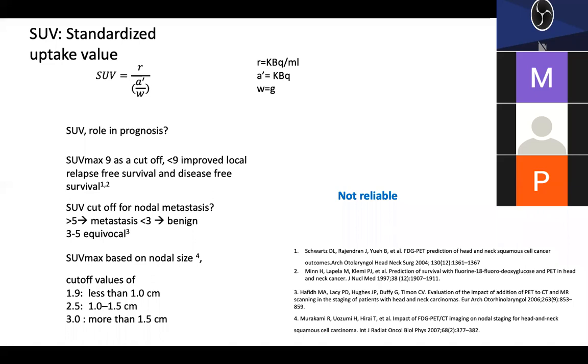But you are right, peritumoral inflammation and all those things matter, and PET also has an effect called partial volume effect, by which if an area of intense uptake is there, it might show falsely increased uptake in the surrounding area sometimes. But we are trained enough to pick up what is partial volume effect and what is not. So because of all these reasons, we don't normally measure the size in fused images.